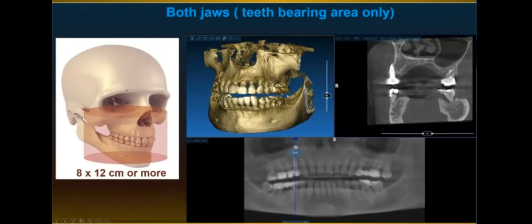Something very important during scanning of the patient for implant cases is to try to make the teeth separated from each other, not closing in occlusion. Because when two metals are occluding together, they intensify the effect of each other.